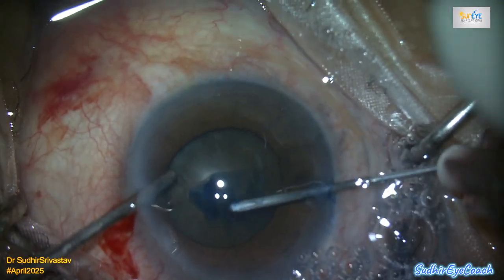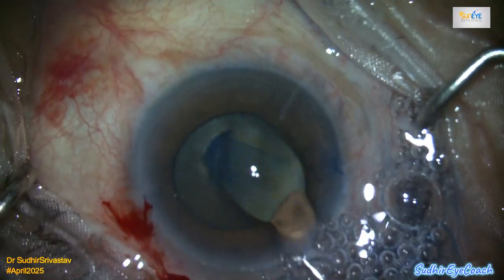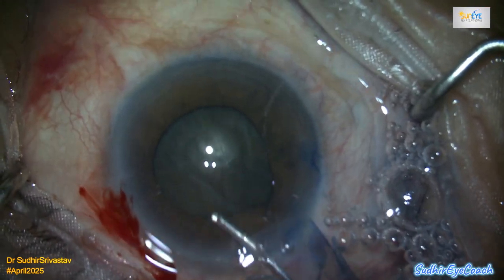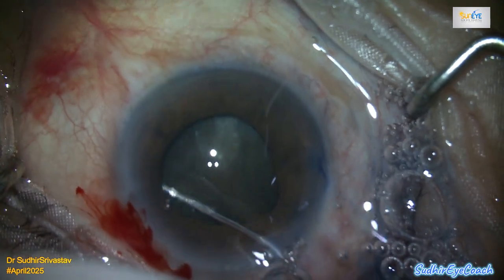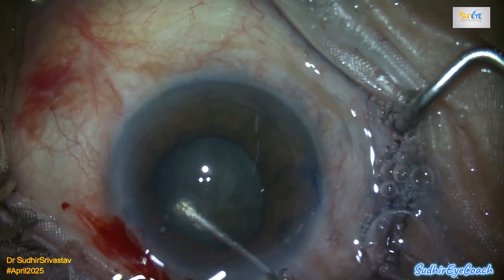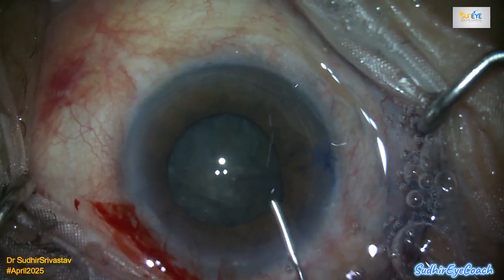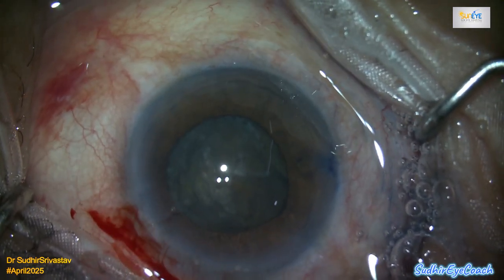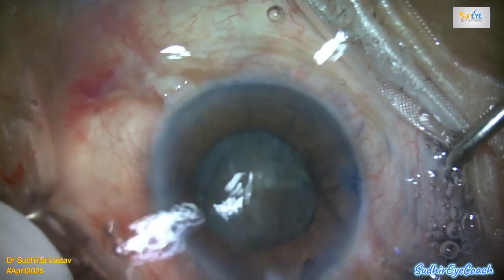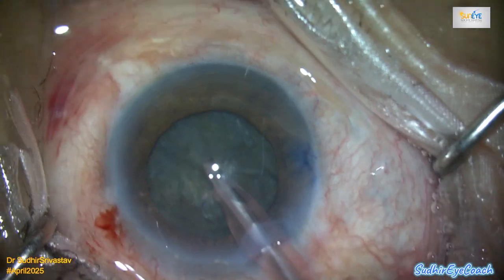But for those who are still learning, I strongly advise not to attempt such cases without proper pupil dilation. Always be ready to use pupil expanders or rings if needed before starting the case. And the reason I am sharing this video is to demonstrate how such situations can still be managed in case you find yourself in the middle of the surgery and the pupil becomes smaller.